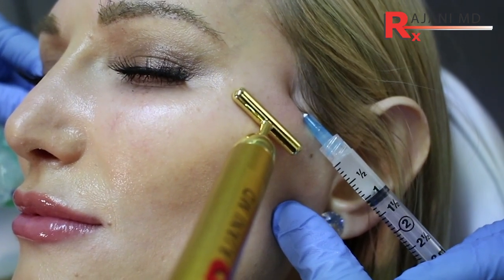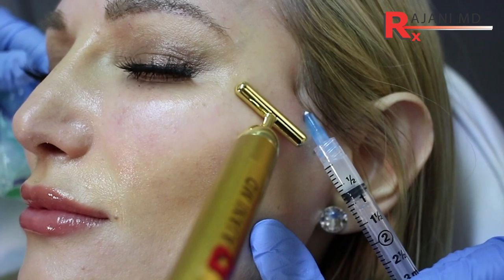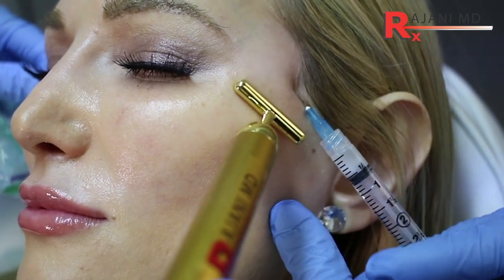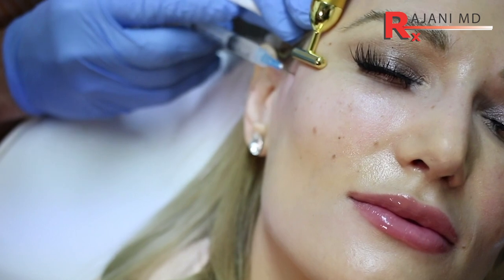The number one needle to use is a 25 gauge 1.5 inch. If we go to a 23 gauge, we get a lot more bruising and it significantly increases discomfort. So the 25 gauge is still the one we want to use. Using the vortex will greatly help reduce clogging and make it more comfortable for the injector.